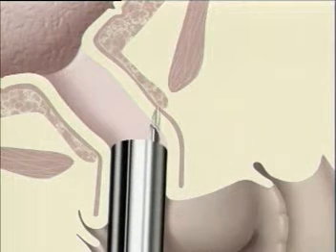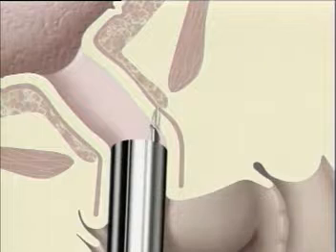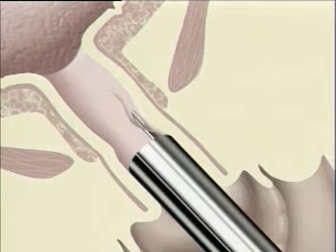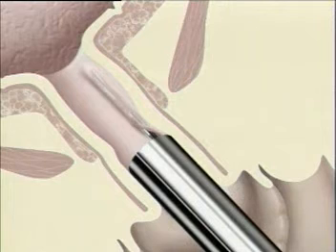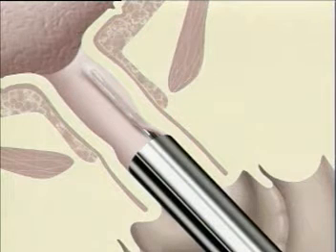Position the needle bevel toward the urethral lumen and puncture tissue at a 45-degree angle until the bevel of the needle is covered in tissue. Re-angle the scope back parallel to the urethra. Tunnel the needle tip towards the bladder neck 1 to 2 centimeters so that the needle tip lies at the proximal urethra.